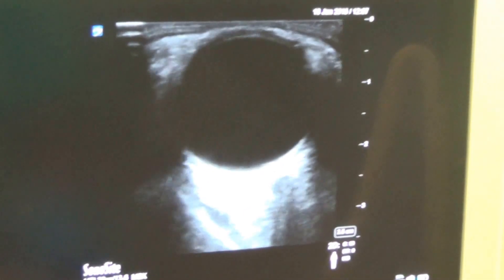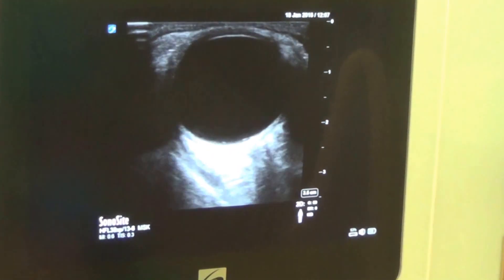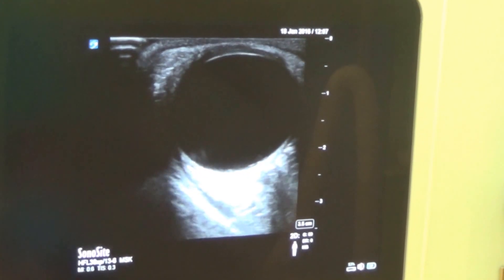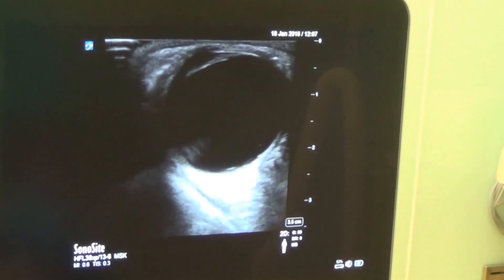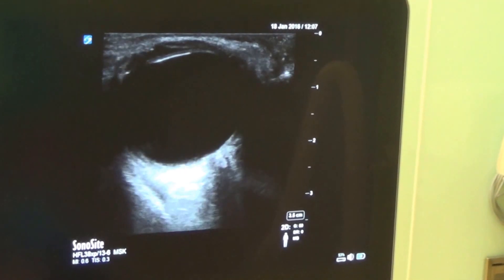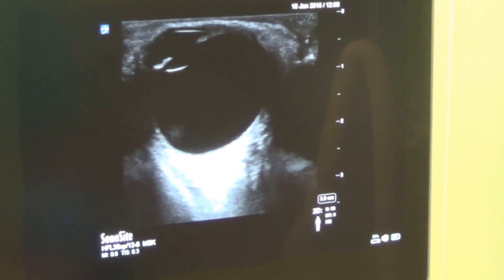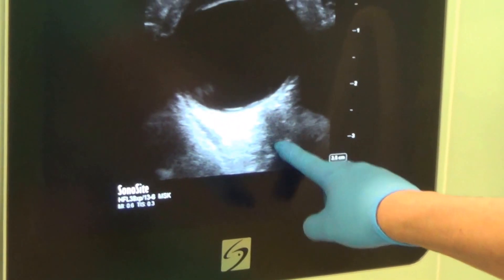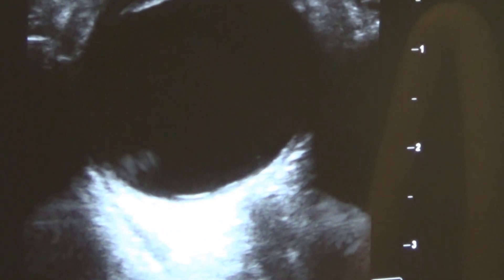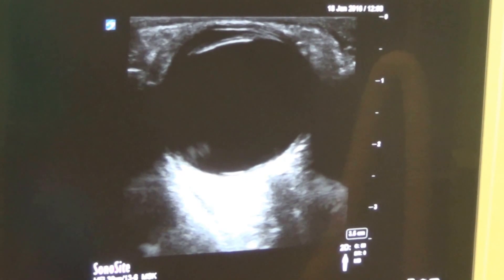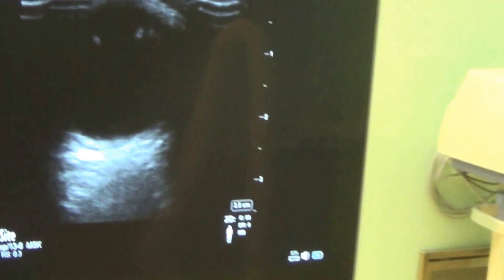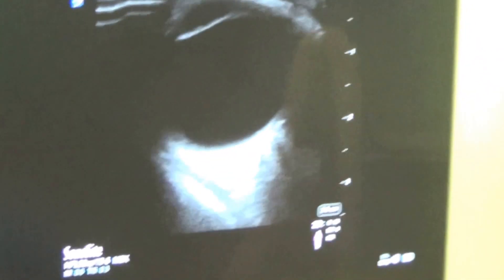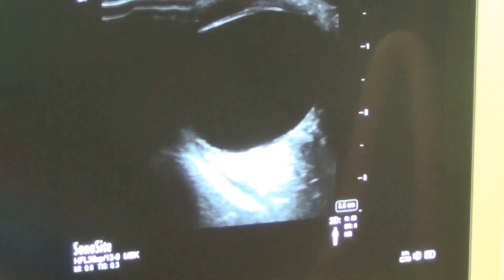You can see the optic nerve. Tell the patient to move their eyeball to the left or right slightly. Once you identify the optic nerve sheath, freeze the image. This dark area here is the optic nerve with a sheath beside it. You have to freeze that area when the structures are clearly delineated and target the sheath. The aim of this video is to show what structures you can see.